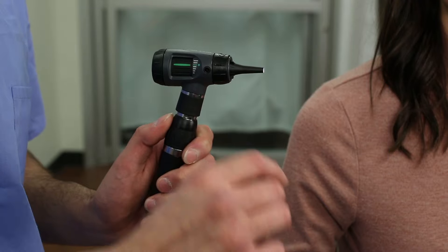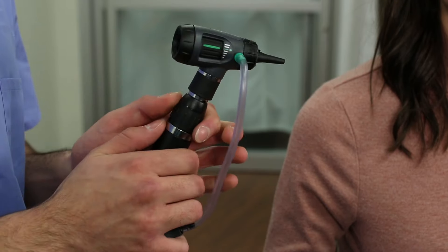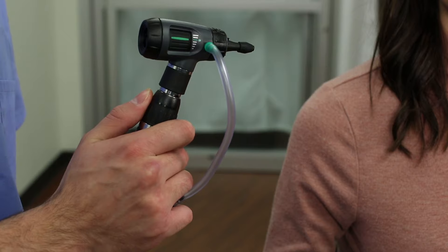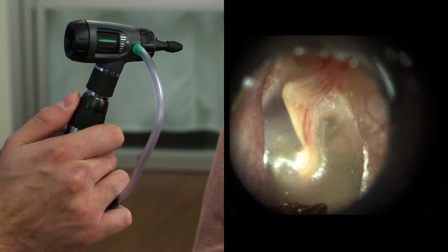Twist the speculum off by hand or rotate the macro view tip grip to eject the speculum. The insufflator bulb can be used to help determine if there is fluid behind the eardrum, which can be a sign of infection. Using Welch Allen soft seal tips can help provide a better seal against the ear canal wall, making it easier to see movement of the tympanic membrane. Use the insufflator bulb to gently puff air at the thin membrane.